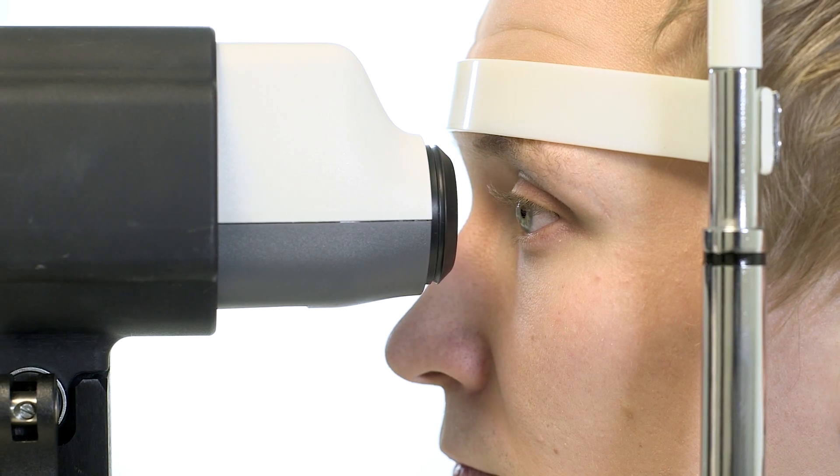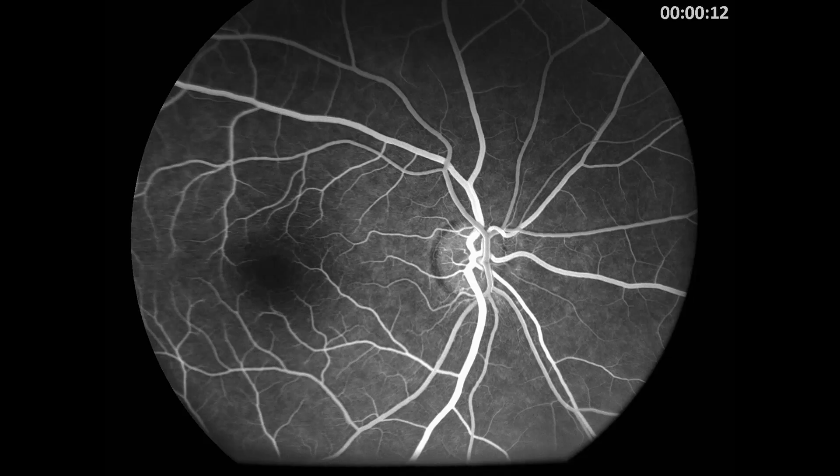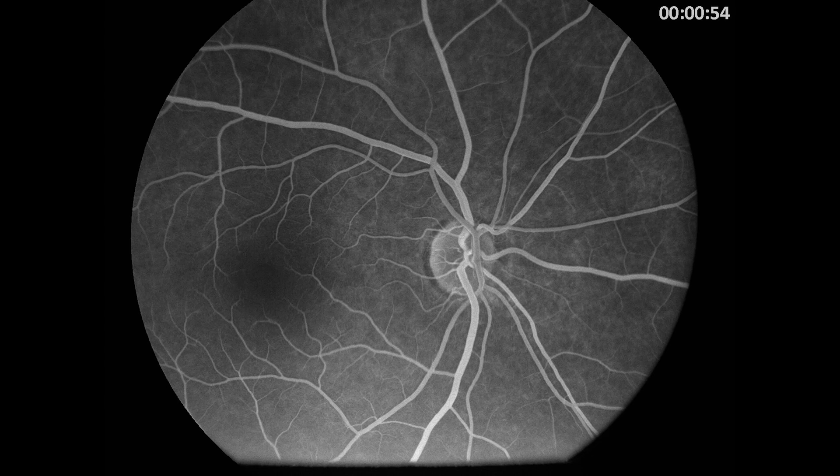The complete test procedure is divided into early phase, mid phase, and late phase. In the early phase, the doctor will interpret circulation in arteries and venous. In the mid phase, the doctor will interpret filling of dye throughout the retina bed and microvascular circulation.